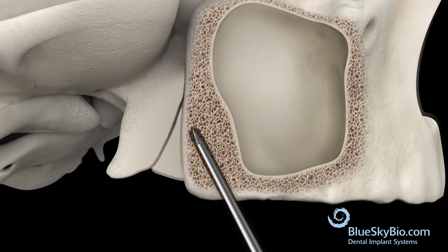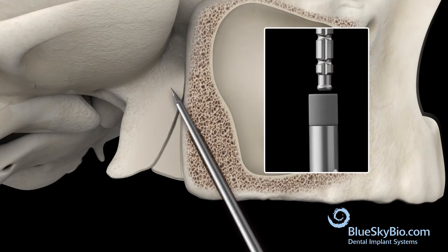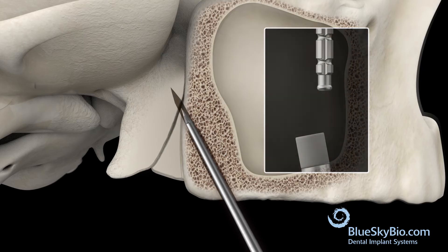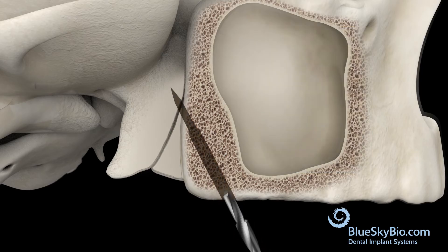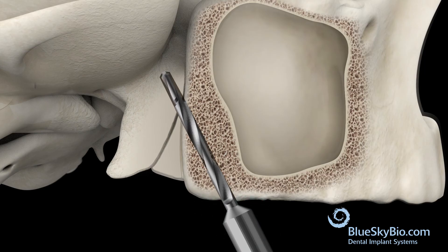Use a metal mallet with the osteotome. You will hear a ping once the osteotome has reached depth. Next, the P2 drill is inserted two millimeters deeper than the osteotome into the cortical bone.